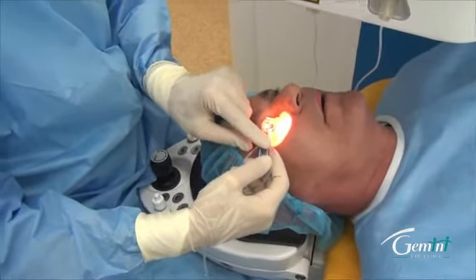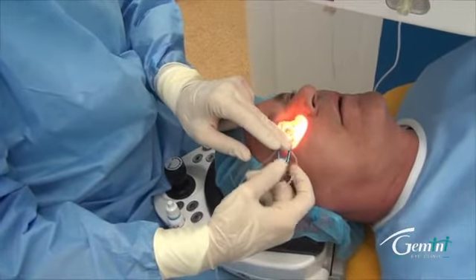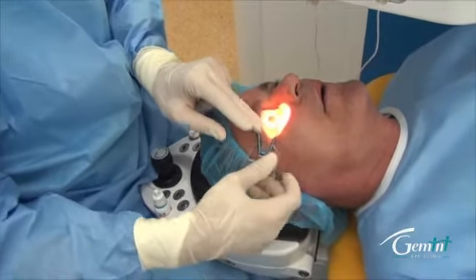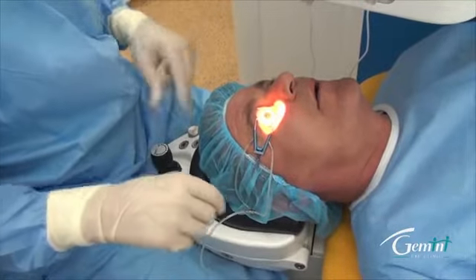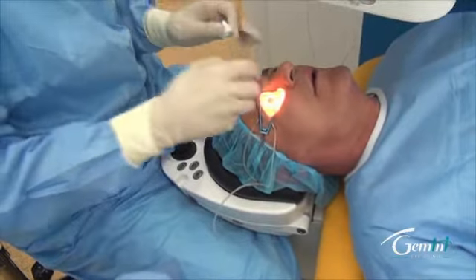Okay, we are going to just open the eye of this patient and put the drops here.